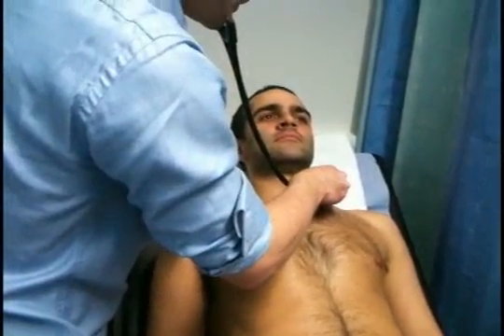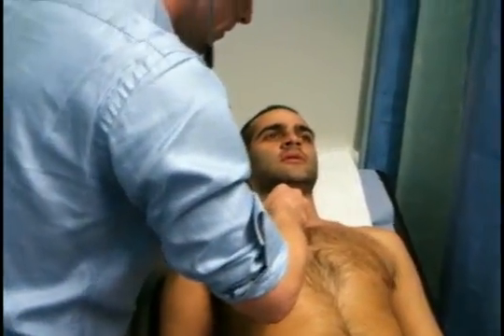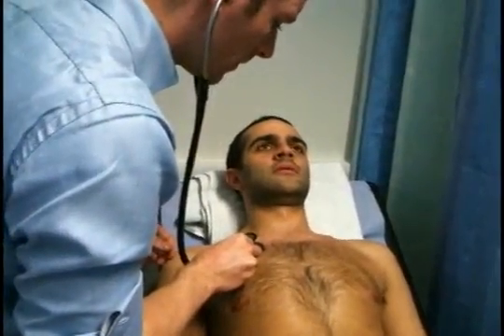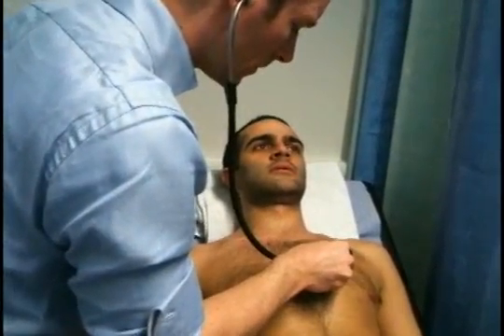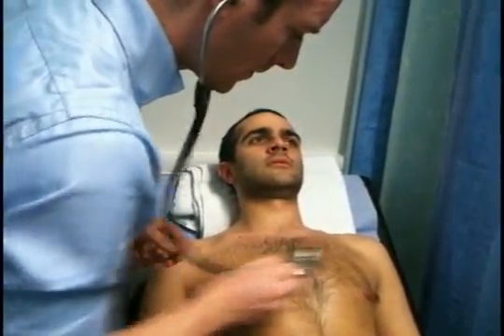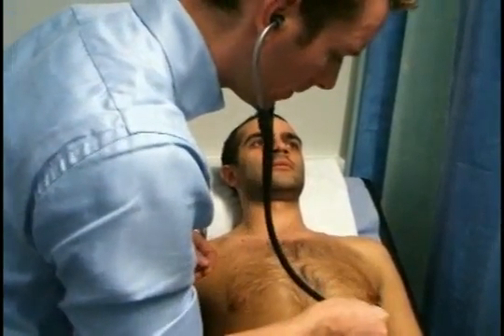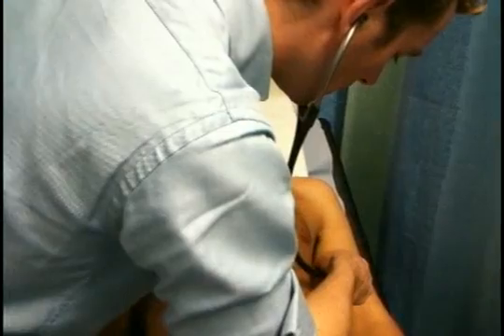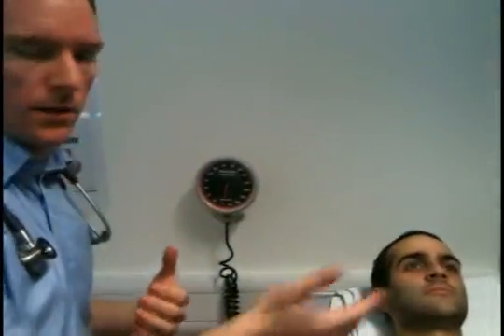Now listening with the stethoscope — asking the patient to take a deep breath in and out each time I move. I could also check for vocal resonance, but as I've already checked tactile fremitus, that's fine. The chest was clear, with no signs of any dullness.